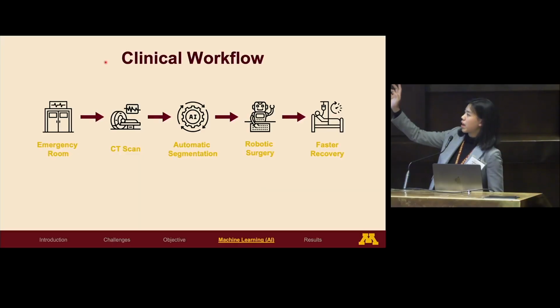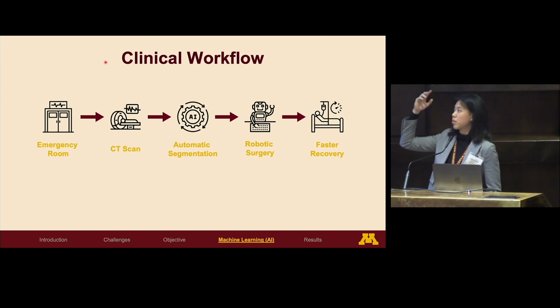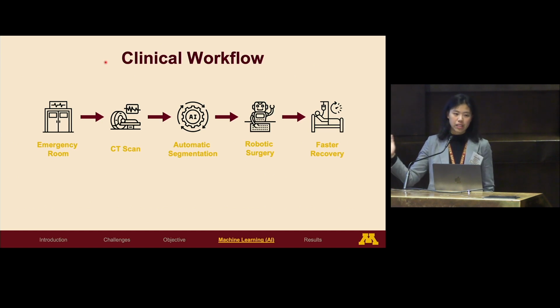Yes, so for sure, I've talked to Mike. Right now we are at the very first stage of this clinical workflow. The first stage is to implement this at the hospital. When a patient gets a head CT scan, it will go through the model right away, and the model will tell you if this scan needs to be looked at by a radiologist right away or not.